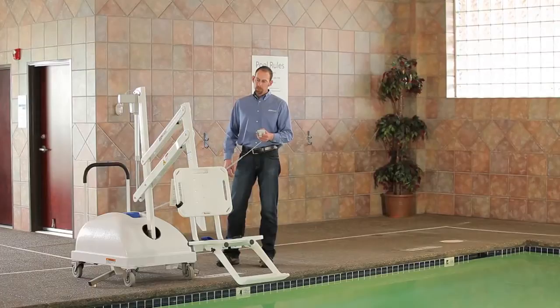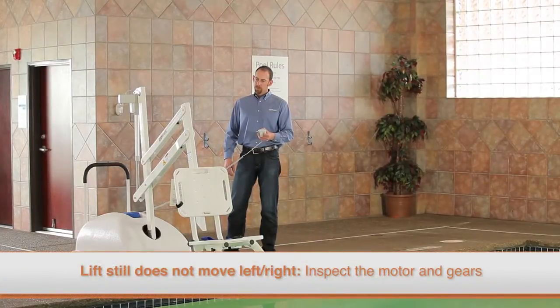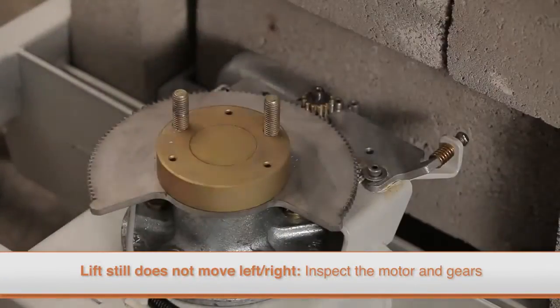You will need to remove the lift from service and replace the control box. If the lift still does not move left and right after completing this test, you will need to inspect the motor and gears.